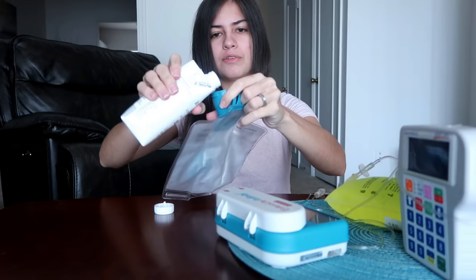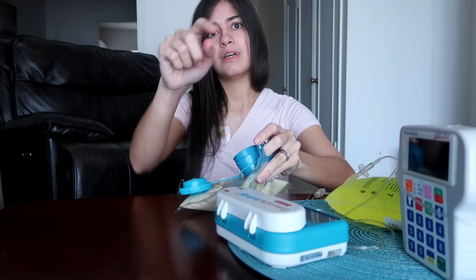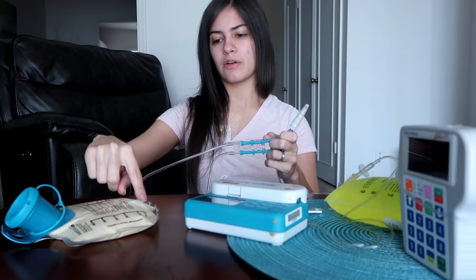Then I try to get as much air out as possible, because if air ends up going into the tubing, the pump will alarm. Less air, the less likely that is to happen. So now I need to prime the tubing, which is where I suck all of the formula through so there's no air getting pumped into my intestines.